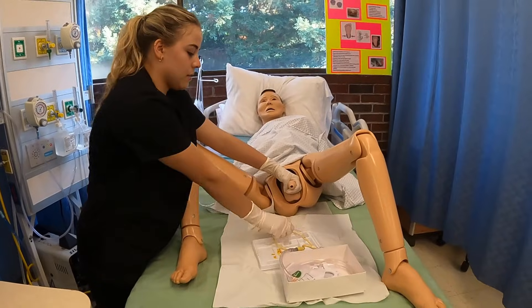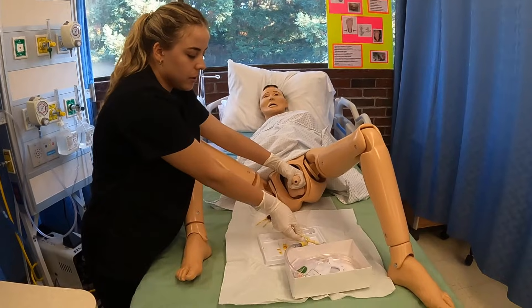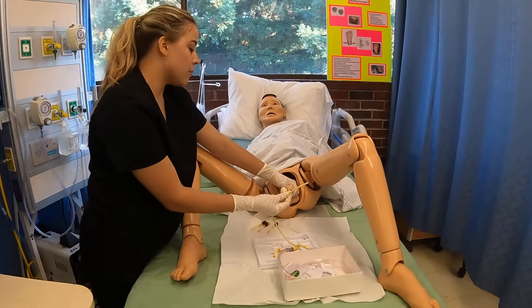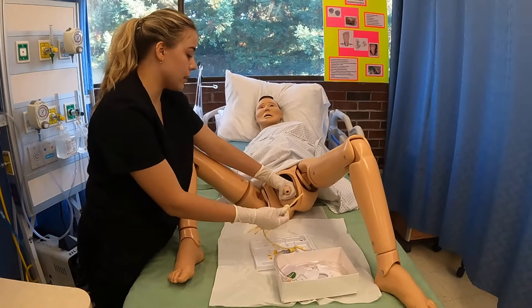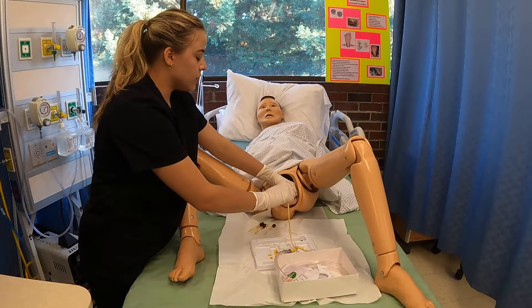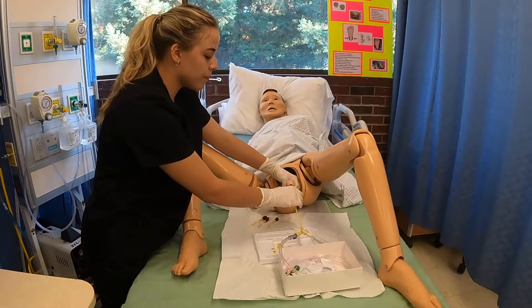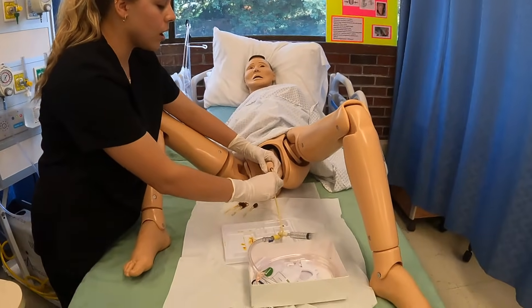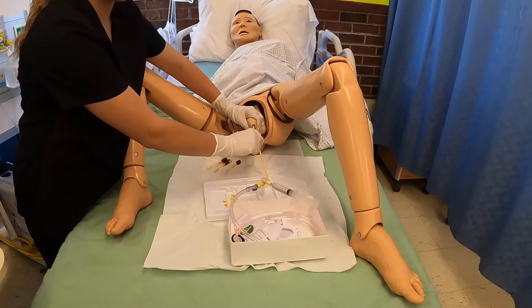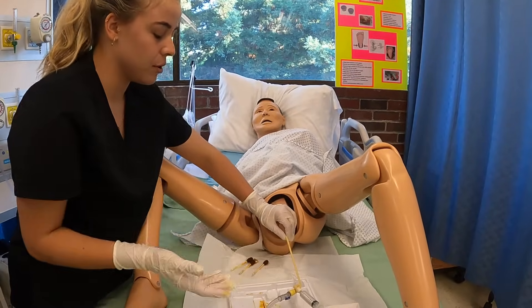Now I'm going to get my catheter. Make sure that it's coated with the jelly. At this point, I'm going to inform my patient to take a deep breath, and I'm going to insert the tubing in — one, two, three, insert. Once you see that flash of urine, that's when you can stop. I see the flash of urine, so now I want to go one more inch going in. Then the hand that was on his penis is going to go down to the tubing and we can move it.